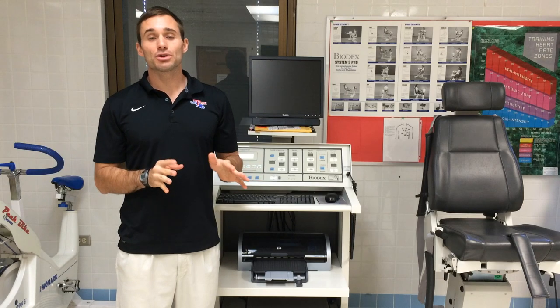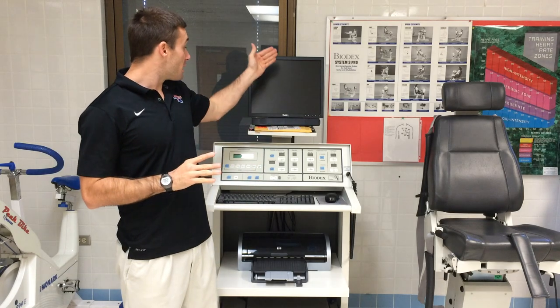So the first thing we have to do before we do anything else is, if we come in and everything's been done right, all the equipment should be turned off. So the first thing we need to do is turn it on.